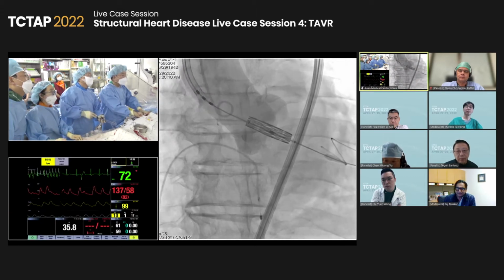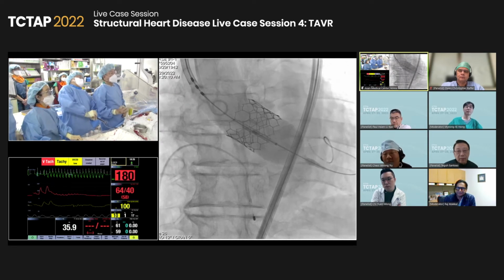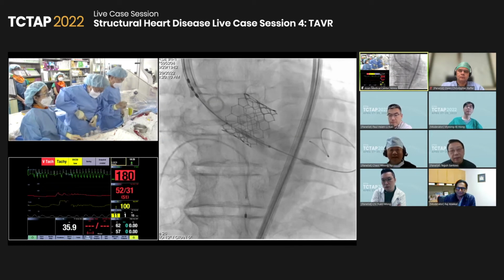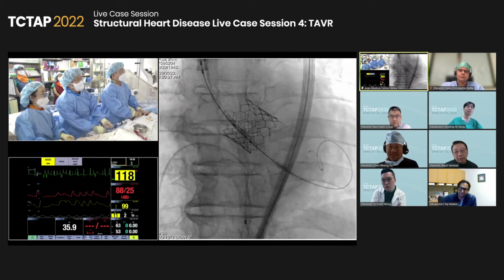All right. Okay, why not? Inflate. Push one in. Okay, good. 3, 4, great. 5. Okay. Inflate. Facing up, please. All right.